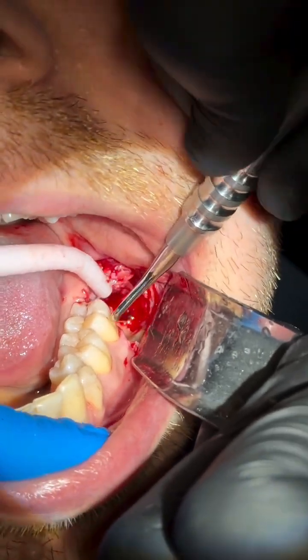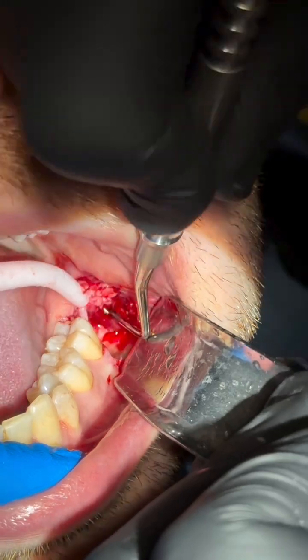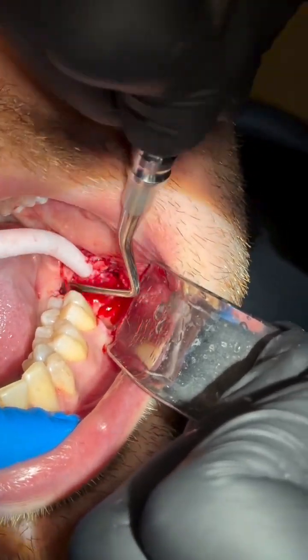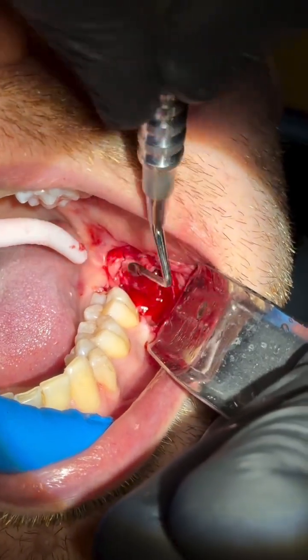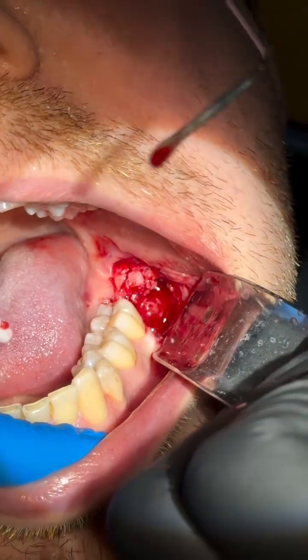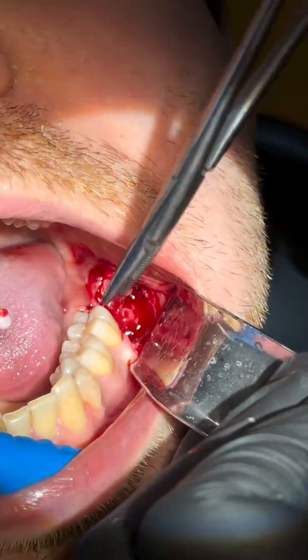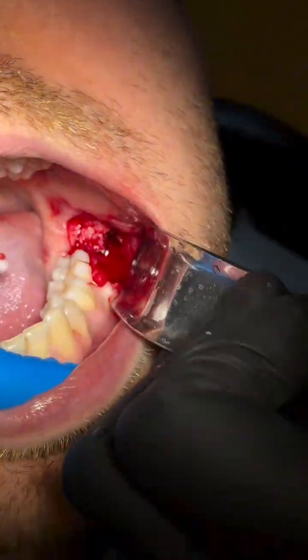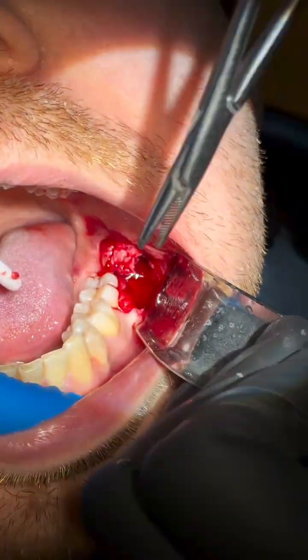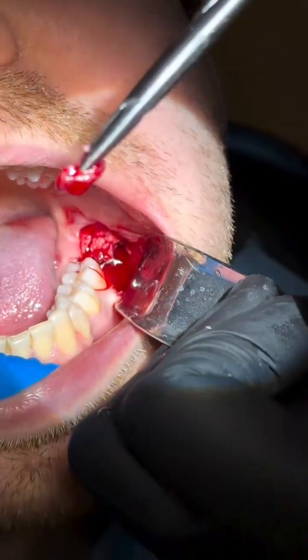Then I'm curetting the socket, removing the cyst, which is most likely a dentigerous cyst associated with the impacted lower left 8. You can see the cystic lining. I'm going to pick it up to send it for histological analysis in formalin. The remainder of the cyst.